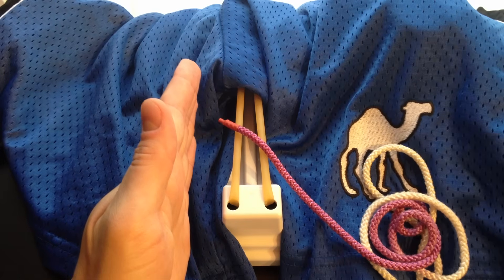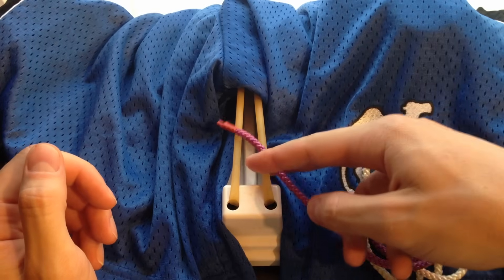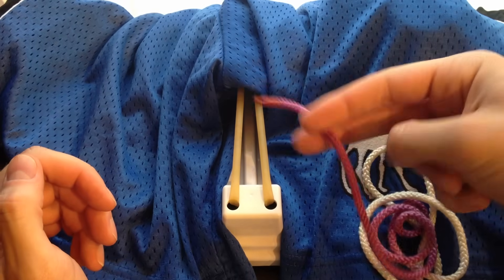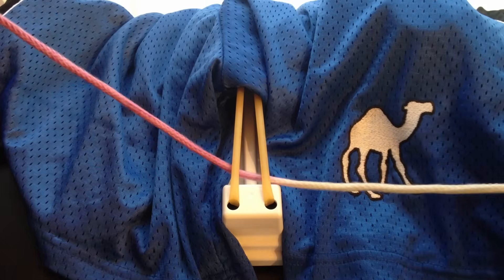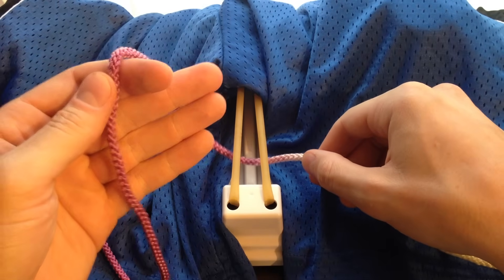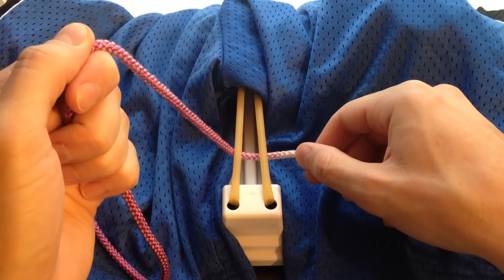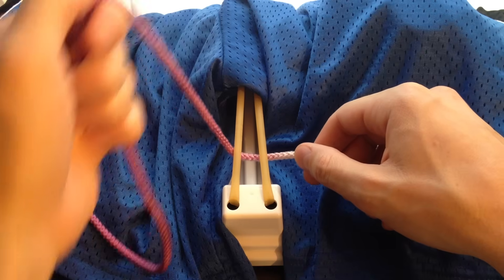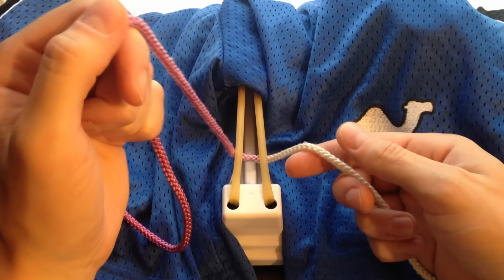As always, we have the incision oriented away from us and the needle attached to our purple thread. We're going to grab our needle with the needle driver and throw our stitch from right to left. So we've got the needle and probably an instrument attached to the purple string — I like to call this the post. Essentially, you're going to hold on tight and not really do too much with your left hand, maybe some positioning, but that's about it. So let's start tying some knots.